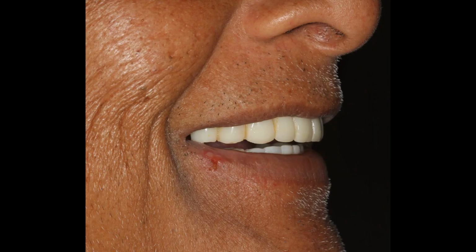In general, the patient and his family and I liked the way the temporaries looked, but while planning for the final prosthesis, we take pictures from all different angles, lips retracted and not, to make sure that our lip support is good, our tooth display is good, tooth projection is good, and then finally we pick a color. Same view as the last side except from the left.